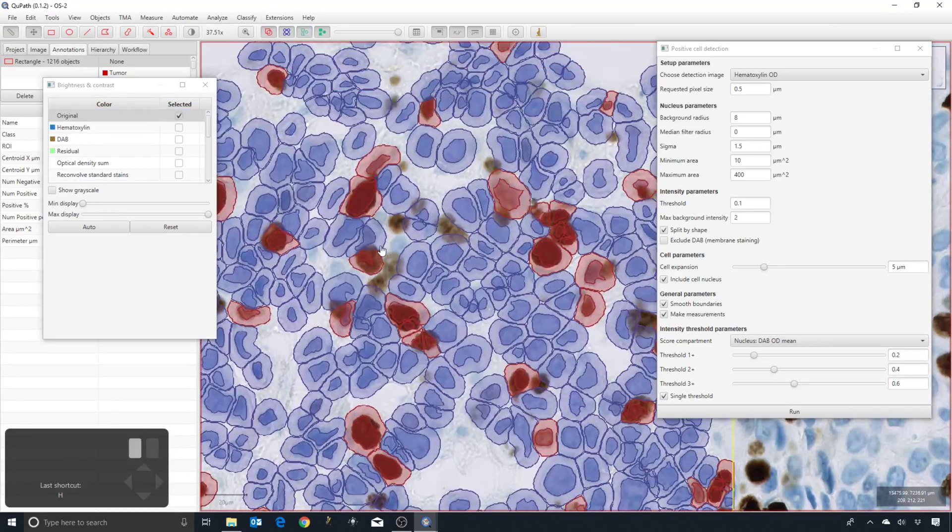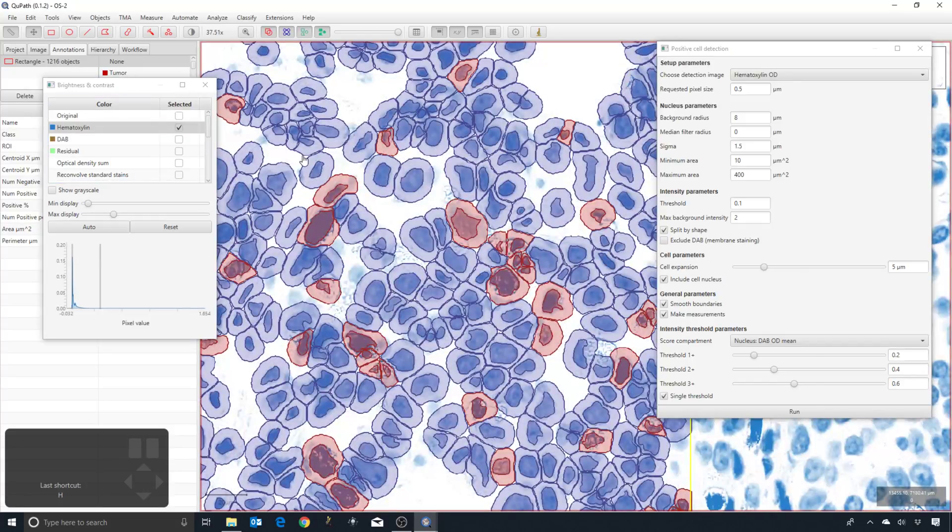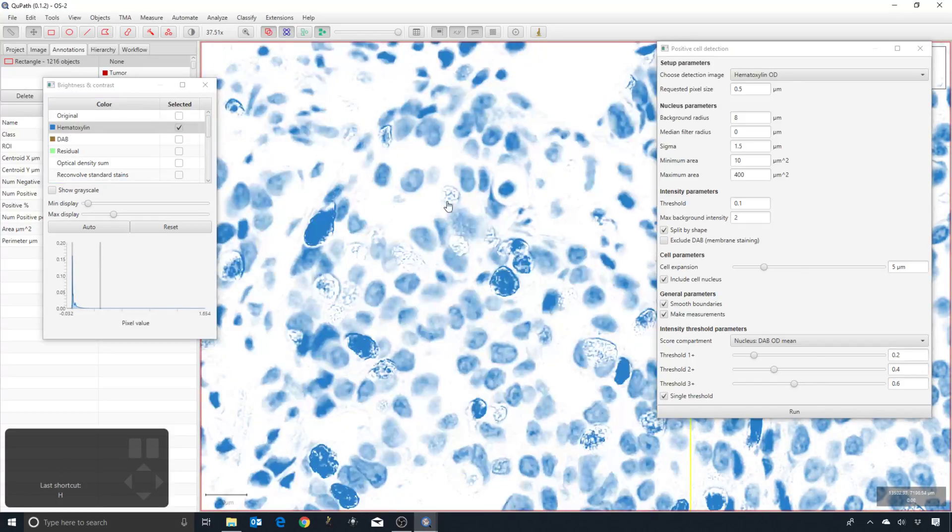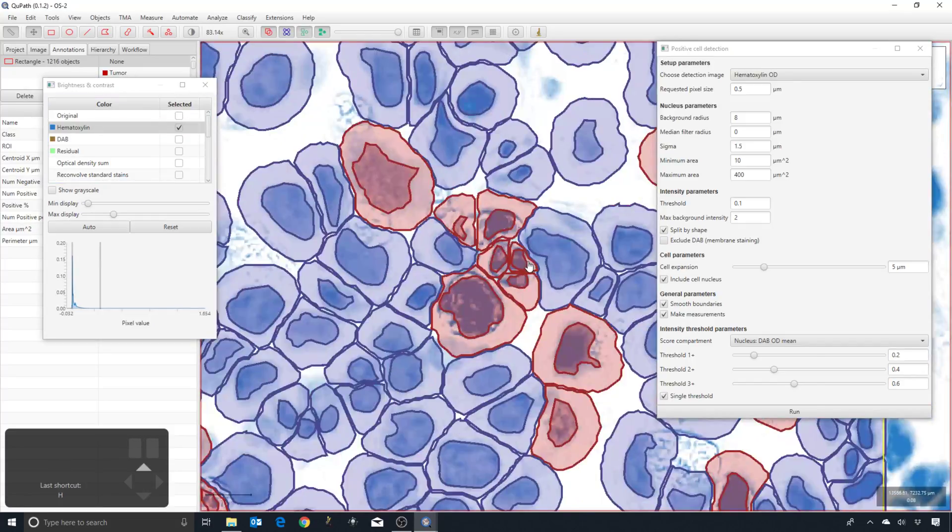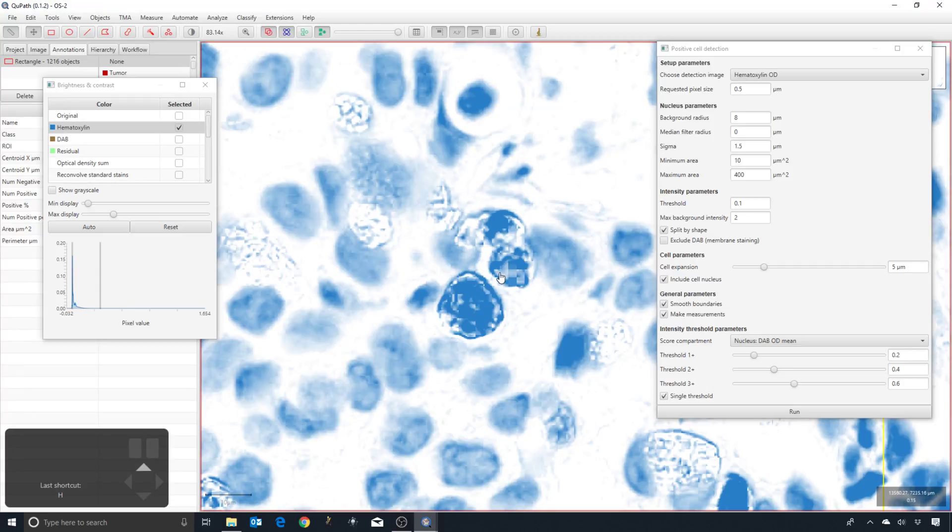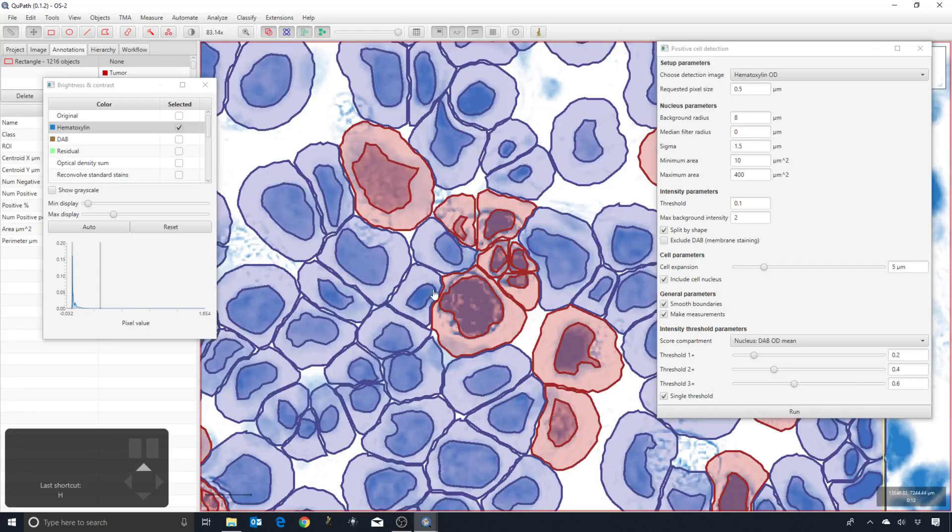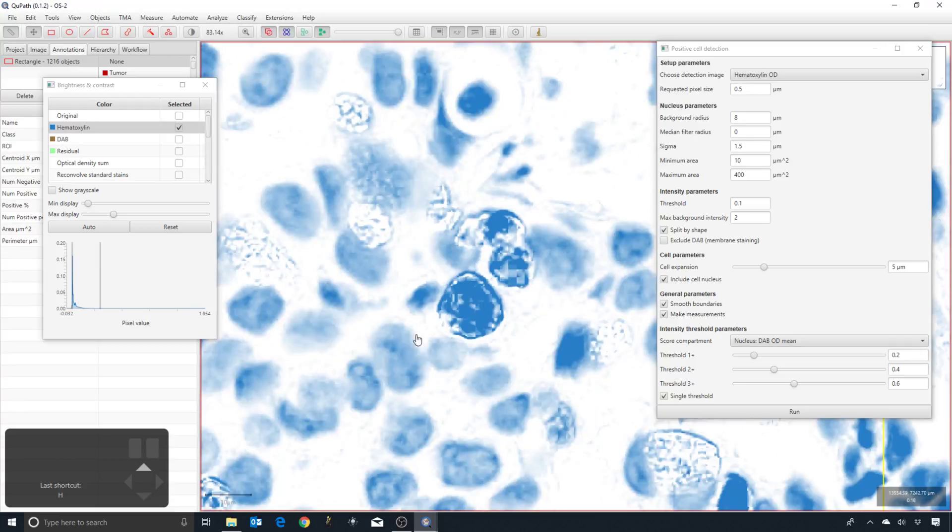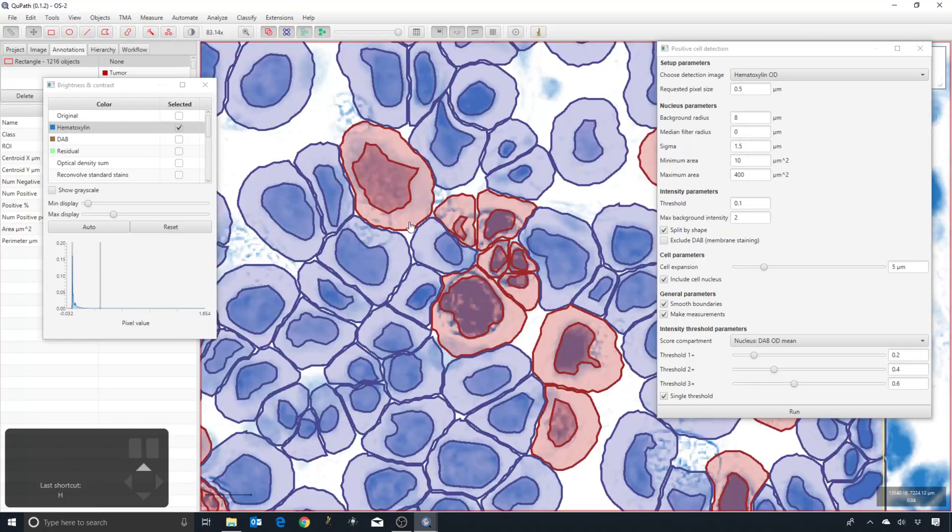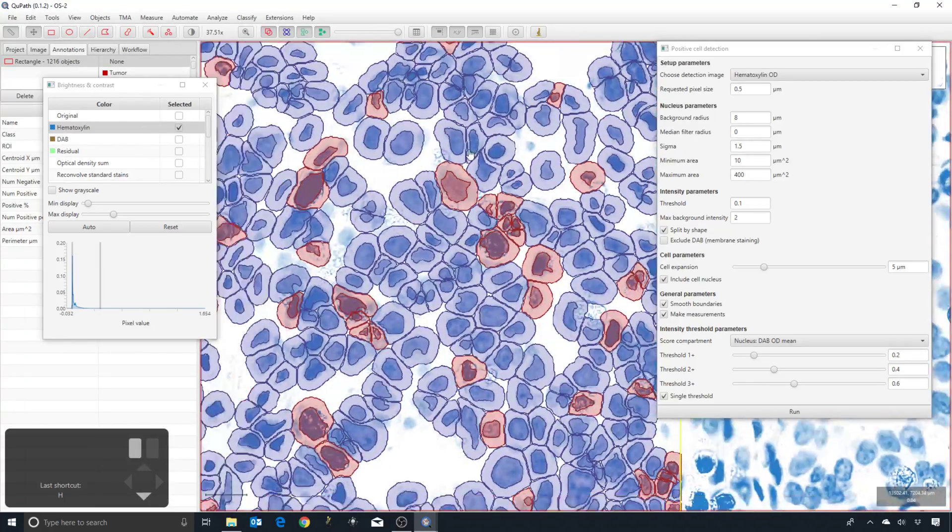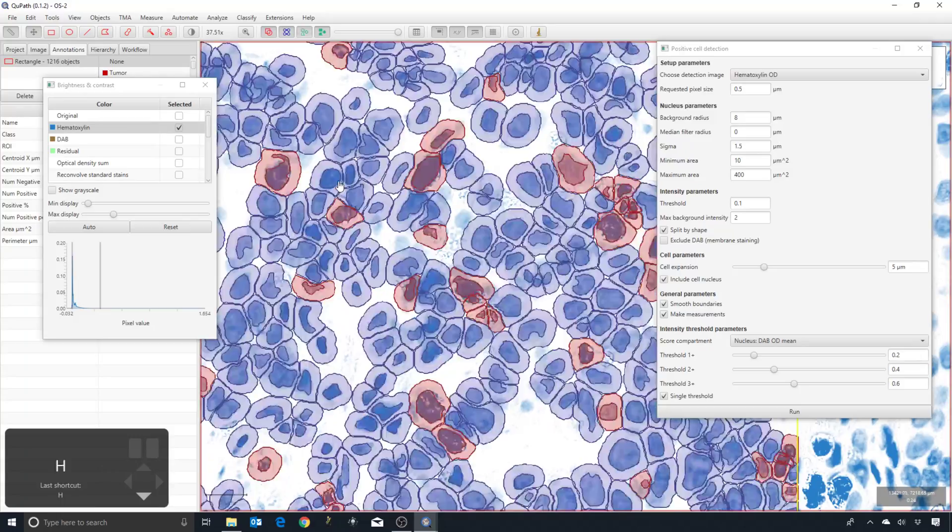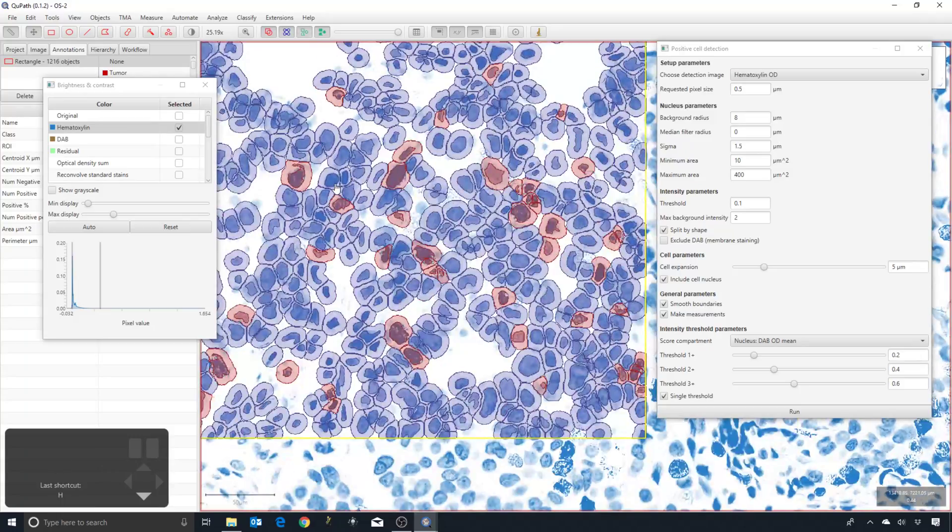It might look a bit strange that this fragmentation has occurred in the original image, but you can see that actually there are darker and lighter bits. Because QuPath is basing the detection upon this hematoxylin image, it starts to make a bit more sense why it's done what it is done in this case.